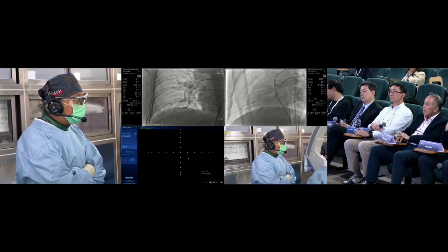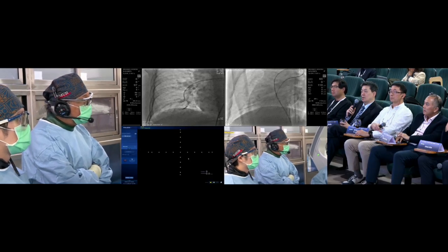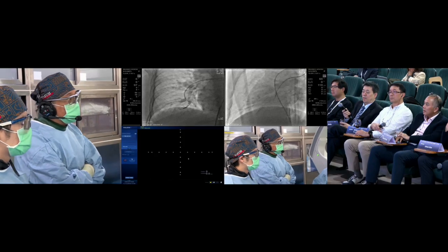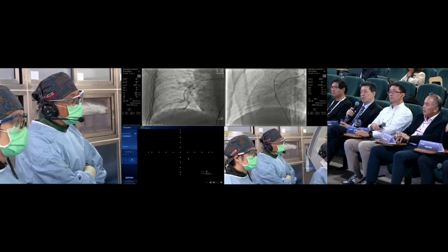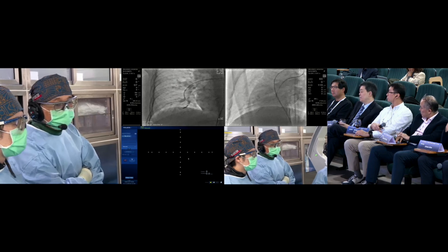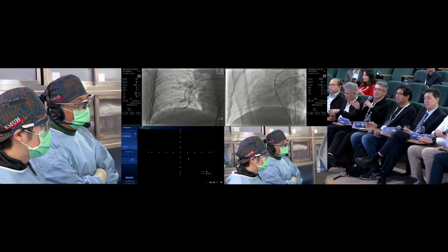Okay, so we're now going to target some more lesions around this area. We will search the pulmonary artery for treatable lesions, branch by branch. So now we are in A9. Maybe we will target A8. Dr. Wu, what would be the end point of your procedure this time? Would you do it until the patient coughs up blood, or would you do as many branches as possible?